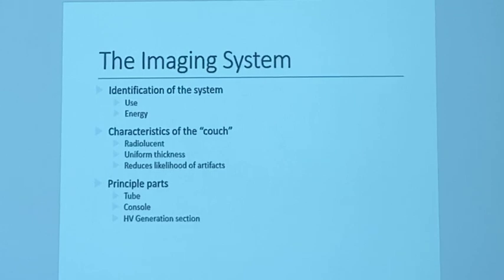All right, so the characteristics of the couch, the table that you put the patient on. I always put the couch in quotations because couch seems like it's comfortable. Have y'all gotten on these things yet? Yeah, I hope so. Just to get a perspective of what your patient has to go through.